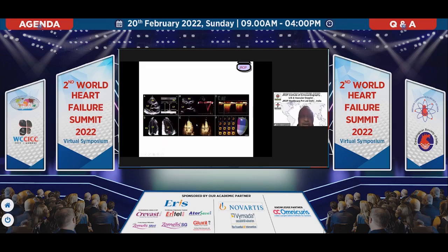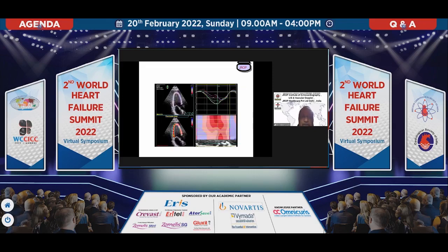We went on to do what next we should do. I say we should go on to do a global longitudinal strain. I picked up an individual frame in this particular patient. Look at the 3-chamber view, you can see a very classical difference. The mid and basal anterior septum are poorly contracting. And on top of that, they show a positive deformation despite the systolic contraction going on.